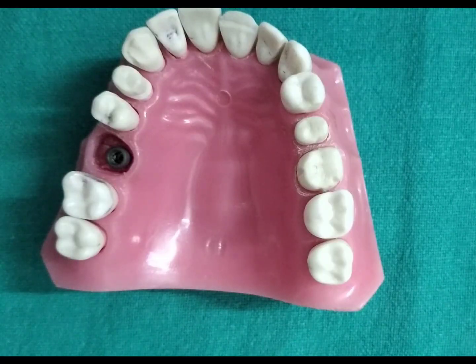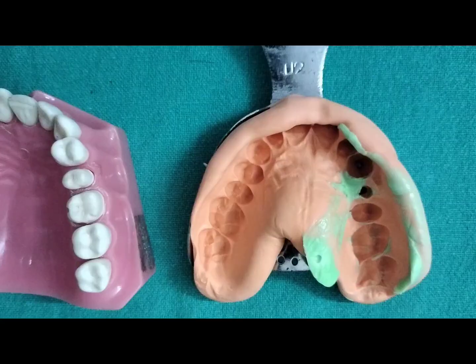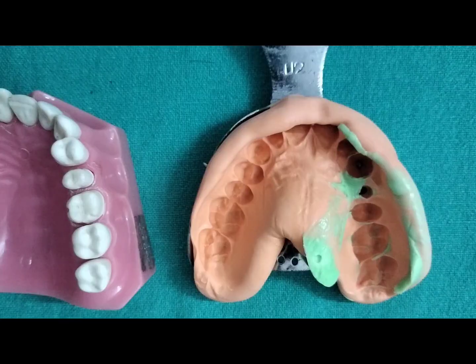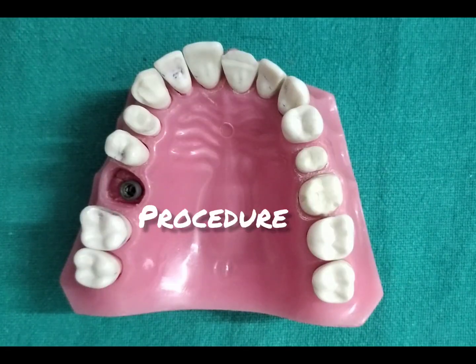So, what is the classification of implant impression techniques? Implant impression techniques are of two types. One is closed tray technique, another one is open tray technique. Now, what is closed tray technique? Closed tray technique, also called the indirect technique or transfer technique, is mostly used in single implant cases. So how is the procedure? Let's see. In a single implant case, we use a closed tray technique.